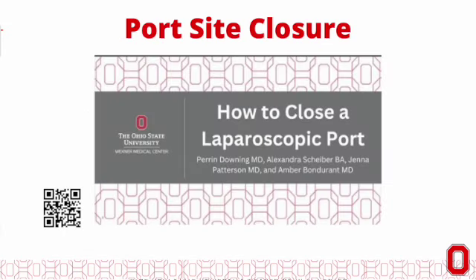Each port site must be closed, cleaned, and covered at the end of a laparoscopic case. Port site closure is relatively simple as it involves one deep dermal suture per port, typically with a thin monofilament suture such as a 4-0 Monocryl on a small needle such as an SH. Scan the QR code below for our full video on port site closure.